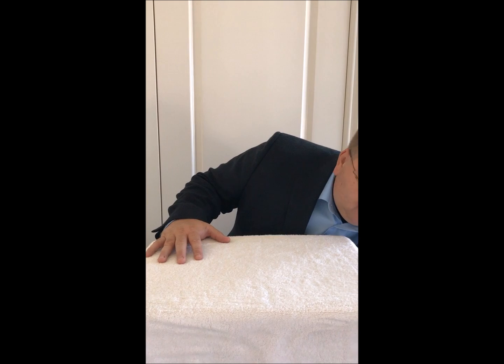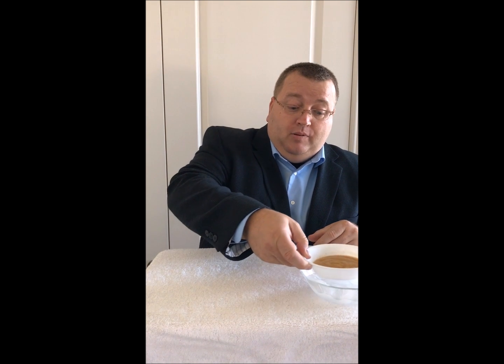or skilled nursing facility. First of all, the nurses will have a cart similar in space to the size of the top of this table. And they've got to get a few things on this table. First of all, there's going to be a small device they use to crush the medication. Then we're going to need some kind of a container that usually has been transferred to applesauce or pudding. And if they're doing it correctly, they usually have some kind of a medium like ice to help keep the temperature stable until they're done.